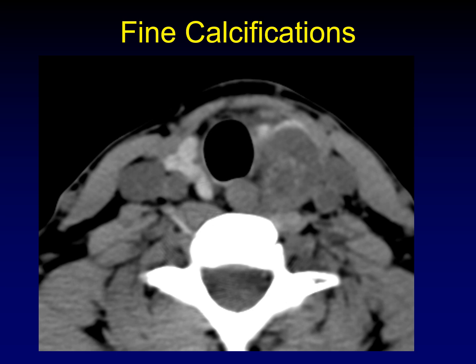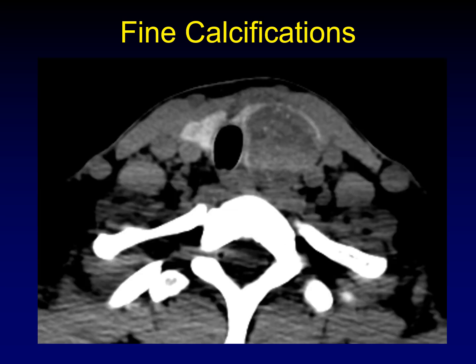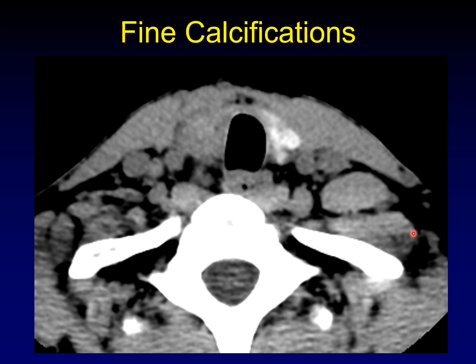How fine do the calcifications need to be to be considered fine calcifications? Look at this example on an unenhanced CT — you can barely make out the hyperdensity in the center of the mass. These are multiple tiny calcifications, none of which is discretely evident on CT because it doesn't have the resolution the way a mammogram has. This is what we're looking for — this easy increased density. Here's another example where you can see punctate dots scattered throughout the mass. Fine calcifications can just look like a haze; your only real clue is that on an unenhanced scan you shouldn't be seeing anything so dense here.